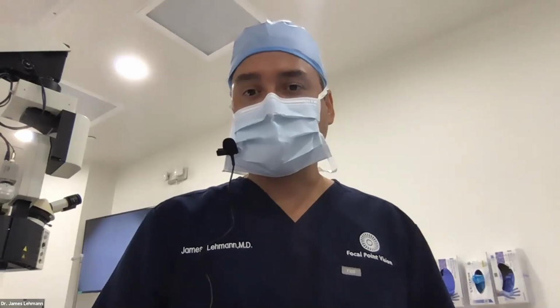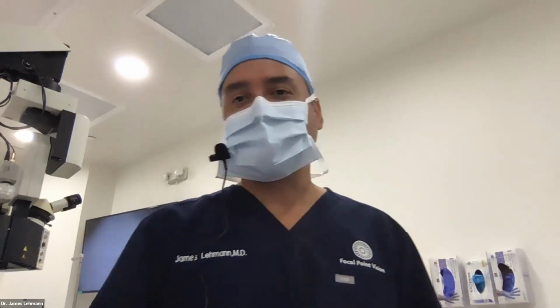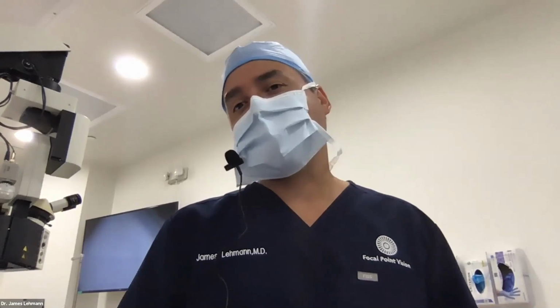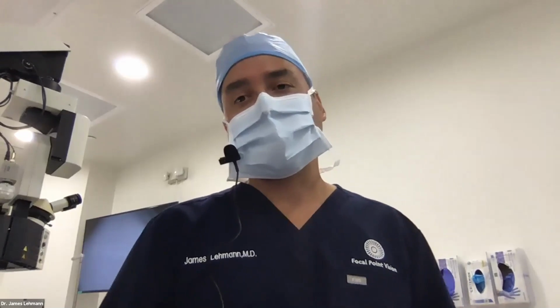Dr. Fard asks, do you use a CTR for myopic patients? I only use a CTR if there's zonular laxity, which you can tell during the case. Generally, it's helpful for like 2 to 6 o'clock hours. I don't use it routinely in myopic patients.